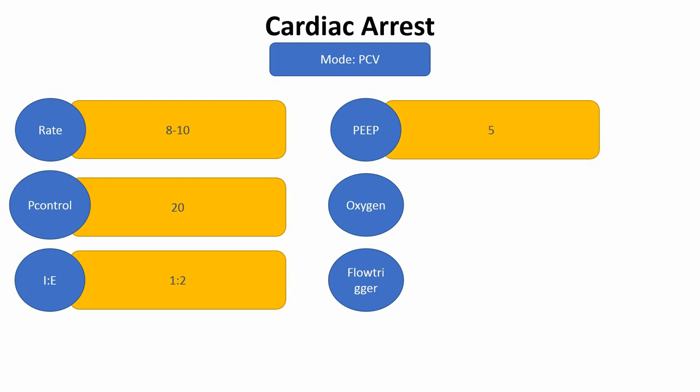A little bit of PEEP we're coming to find is actually beneficial in cardiac arrest, and it can improve cerebral blood flow. If you leave the lungs a little bit filled, the lungs are like a sponge, and if they're not filled, then that blood could just settle. And if the lungs are a little bit inflated, then it helps facilitate blood flow through them. Your oxygen, we're going to put that at 100% because they're in cardiac arrest.